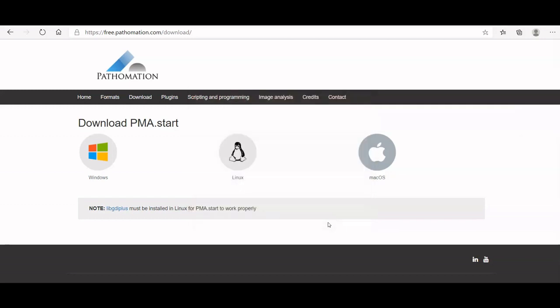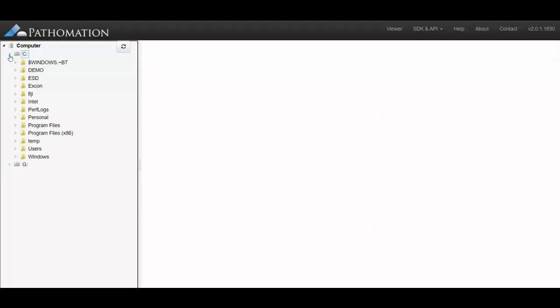After installing, the software runs immediately, so you can start viewing your whole slide images right away. I will show you one of mine.